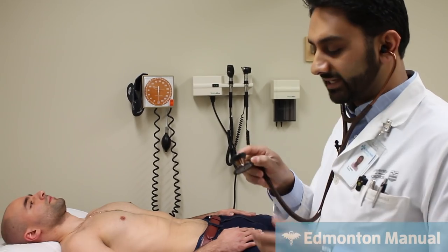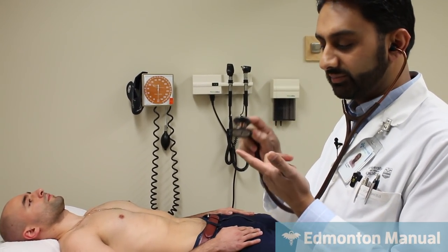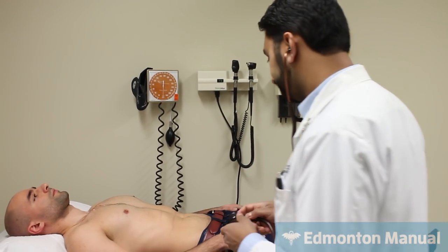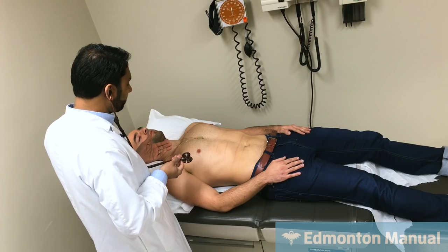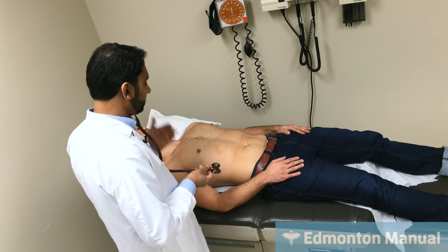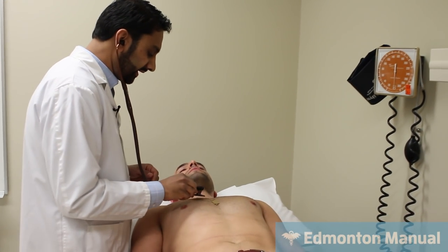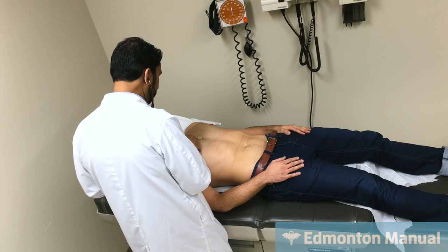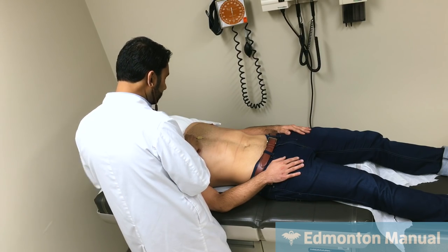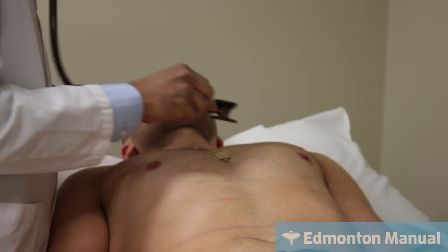So now we're going to actually examine this patient, showing you what we can do with both modulating the pressure or flipping it over. So we're going to presume we've already done inspection and palpation. So moving on to auscultation, the four cardinal areas. So I'm listening over the right upper sternal border, pushing down as you can see with diaphragm-like pressure. And I can hear S1 and S2 very nicely.